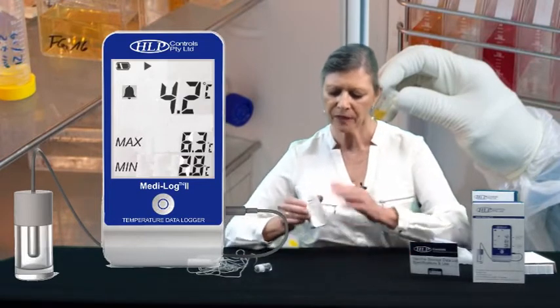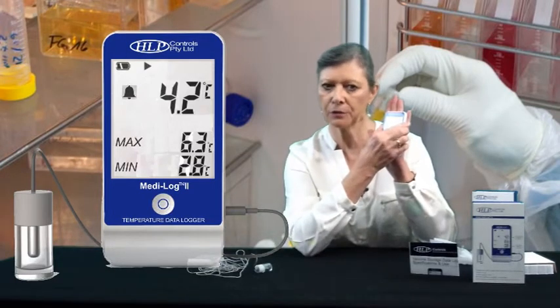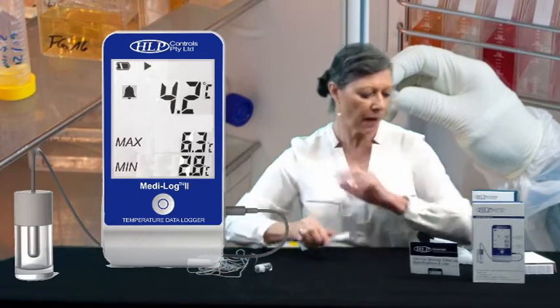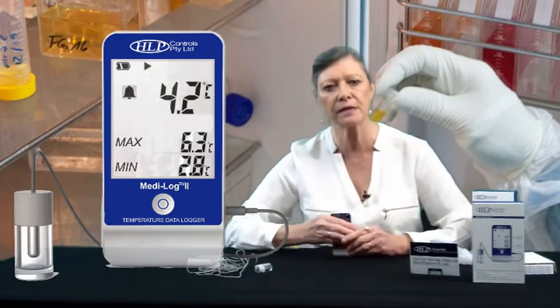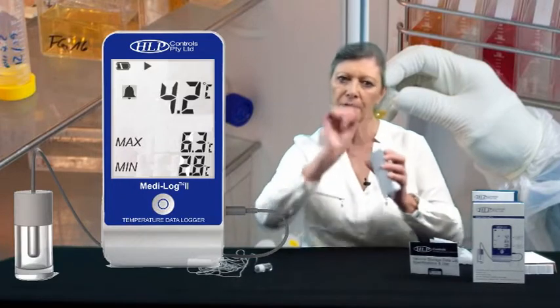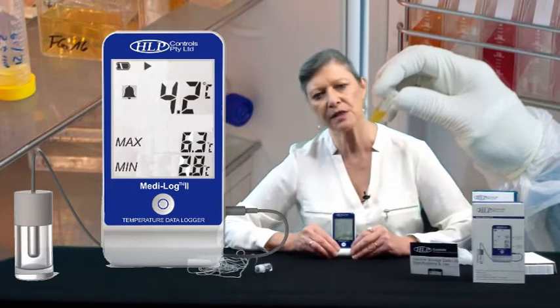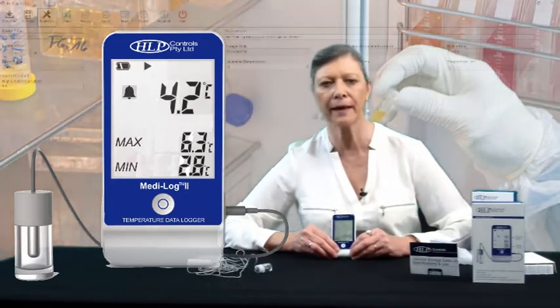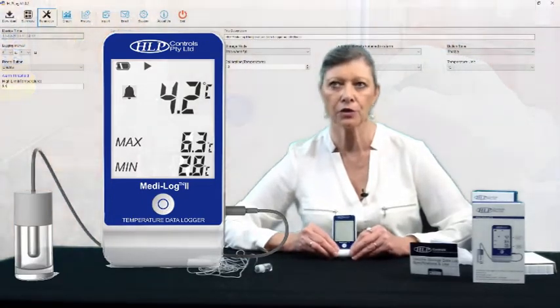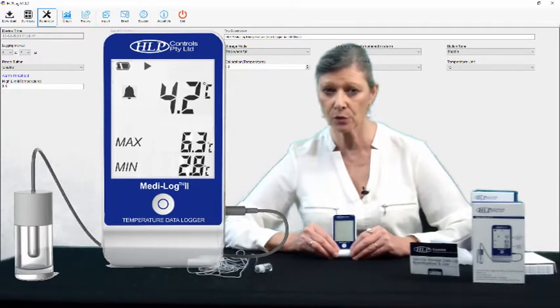Mounting the unit: it's got magnets in the back, so you can attach it directly to the side of the fridge if it's magnetic. Otherwise, use the hook and loop fastener — peel off the backing, stick it to the unit, peel off the other piece, and stick it to your fridge. It comes with everything, so it's ready to go straight out of the box. You don't have to buy anything else to make this unit work.